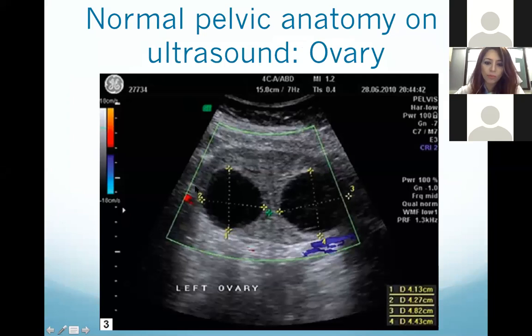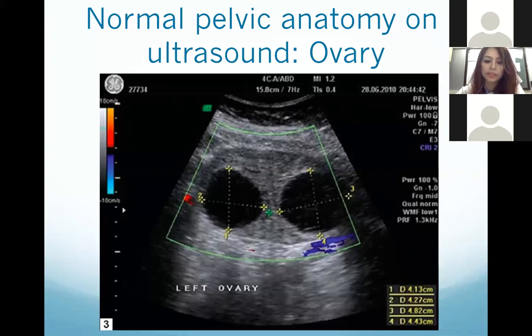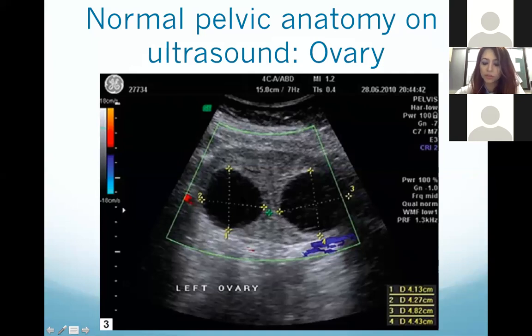This is a normal ovary — this gray oval-shaped structure — with two normal-looking follicles in it. These black areas are the follicles. On ultrasound, fluid always looks black. Whether it is the urinary bladder, gallbladder, ascites — all fluids are black on ultrasound. So these two black circles are the normal-looking follicles in the ovary.